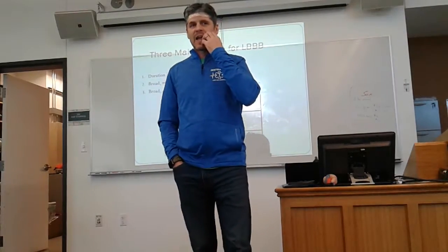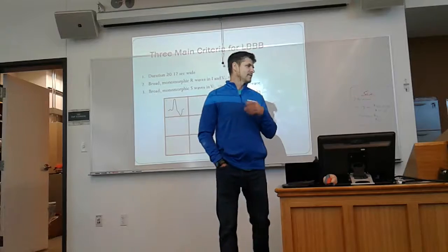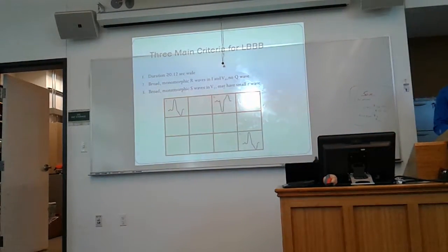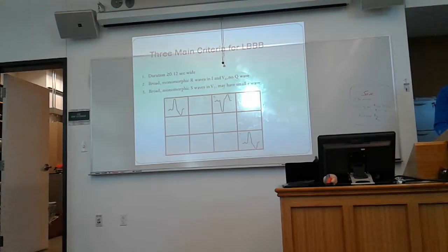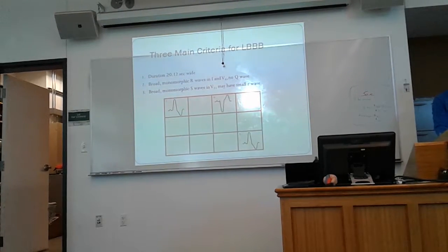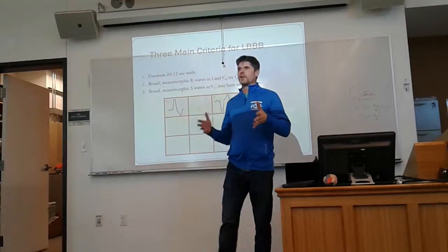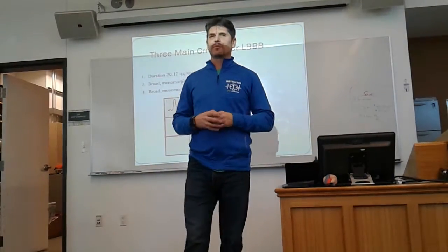Doesn't lead 1 on 12 look like a slurred S wave? Number 12, the one we just looked at, you mean? I was going to say 16. He's looking at number 12 and lead 1, and he's trying to suggest that maybe there's a big slurred S wave there. What is that? That's the T wave, because it's inverted down, that's right. So sometimes we will have criteria of both, but not the criteria of either completed.